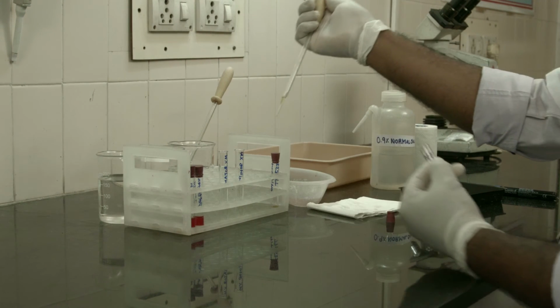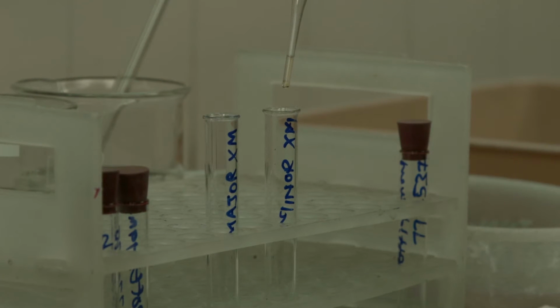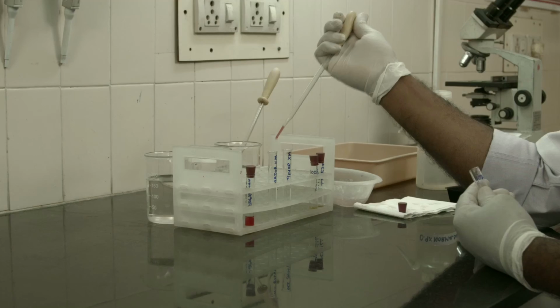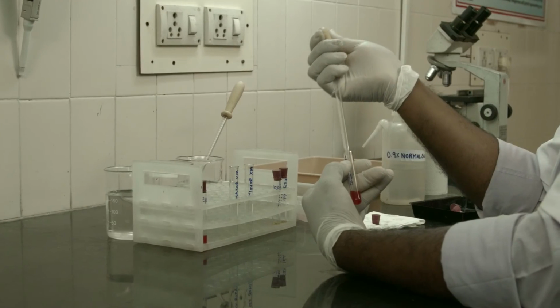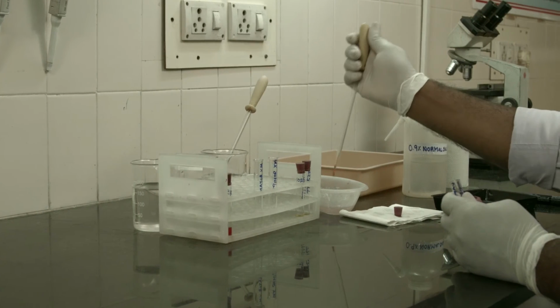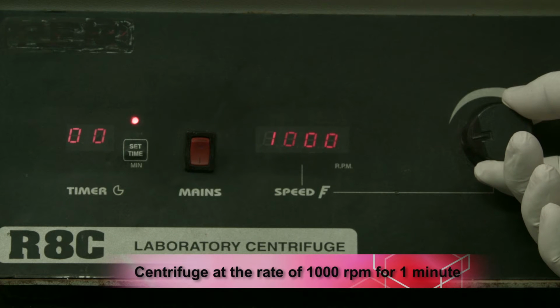Add 2 drops of donor serum or plasma for minor crossmatch in the crossmatch labeled tubes. Add 1 drop of 2 to 5% cell suspension of donor red cells for major crossmatch and 2 to 5% cell suspension of patient's red cells for minor crossmatch to the above test tubes. Centrifuge at the rate of 1000 rpm for 1 minute.